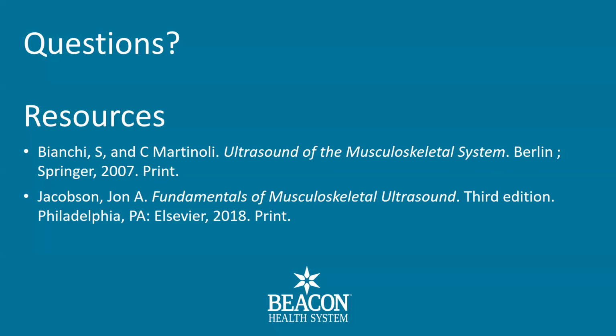The couple I've seen are similar to Mitch's. They're often associated with hardware. I've seen one associated with a knee arthroplasty. But I rarely see an actual abnormality of the Pes Anserine tendons or bursa when referred. So I'd be interested to know what other people's experience is.